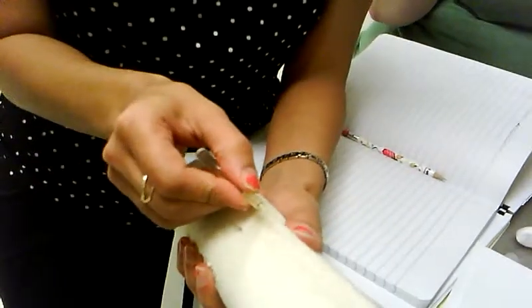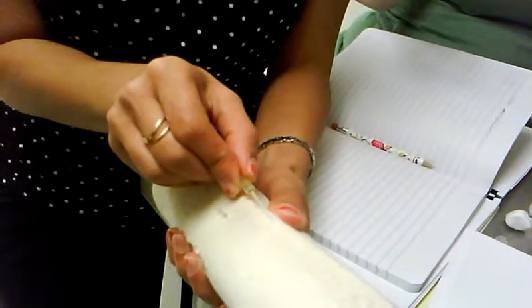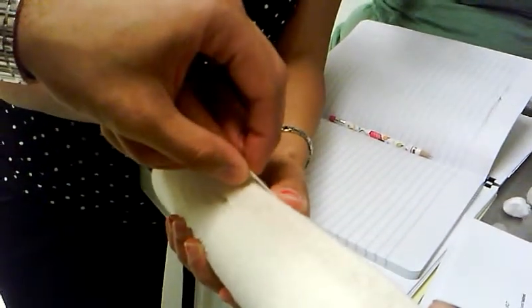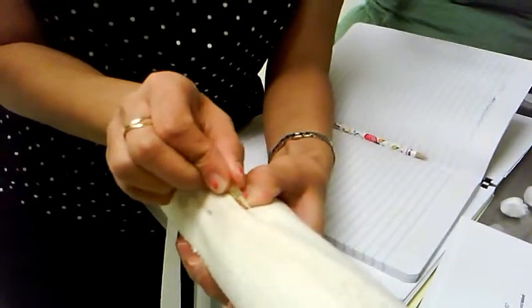You go 45 degrees. Just flush it. 45. Go off to the side. Pretend. And then alcohol once you're in.